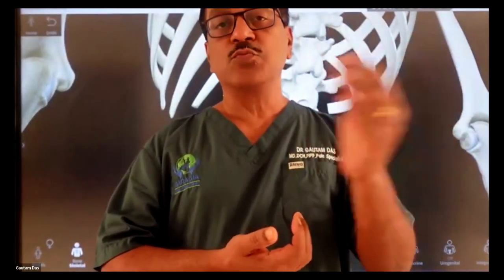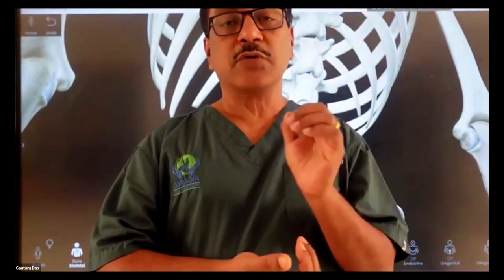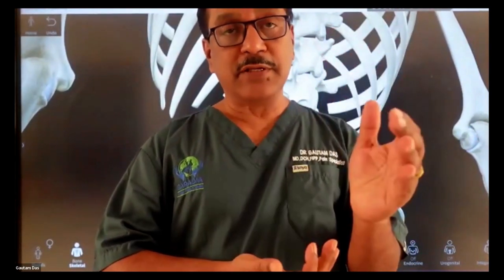Today we are going to discuss the lumbosacral procedures, C-arm guided lumbosacral procedures. The next two modules will be on ultrasound-guided peripheral and ultrasound-guided spine. Today will be C-arm guided basic lumbosacral procedures. We'll be concentrating on the lumbar and the sacral area, and I'll be demonstrating the procedures on the mannequin.